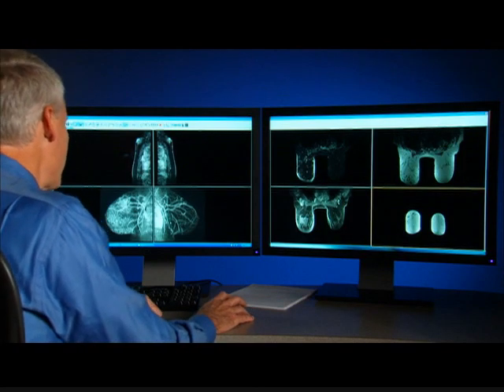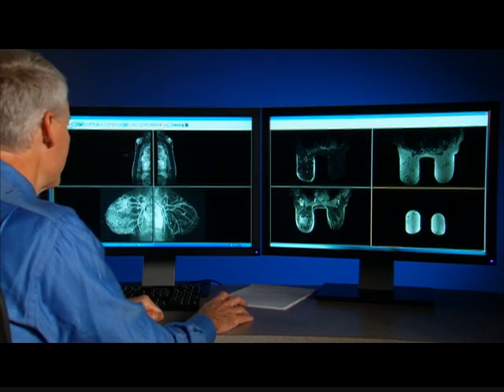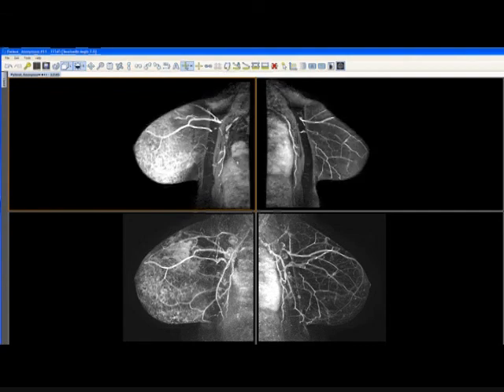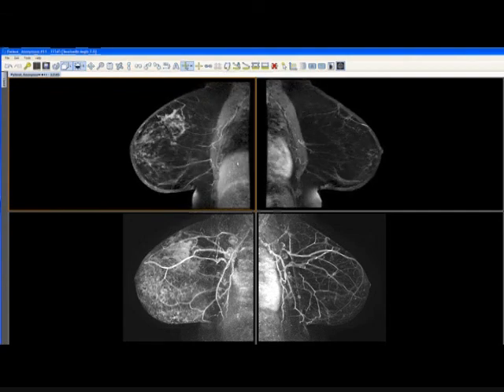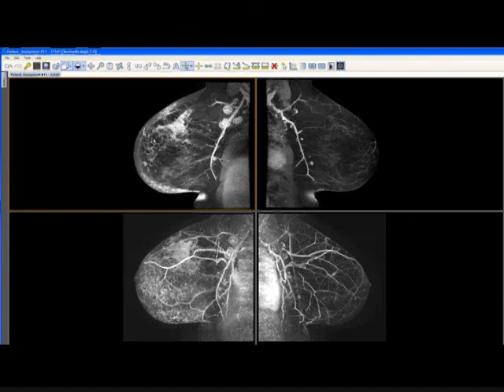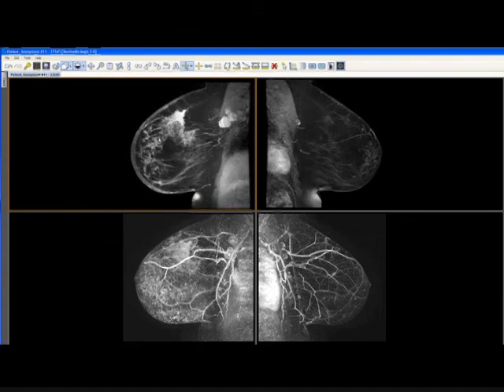Here is the breast MRI exam, again from the initial 1-minute subtraction MIPS, a normal appearing left breast, obviously early phase imaging with a prominent vascular enhancement, and clearly diffuse abnormality throughout the right breast. In this case, with clinical inflammatory cancer, this does demonstrate actually an underlying discrete mass. As we look through with the thin MIPS, you can see this large spiculated area, somewhat mass-like with a large surrounding volume of non-mass-like abnormal enhancement within the right breast. The other thing to notice, though, is the thickening of the skin as well as enhancement of the skin.